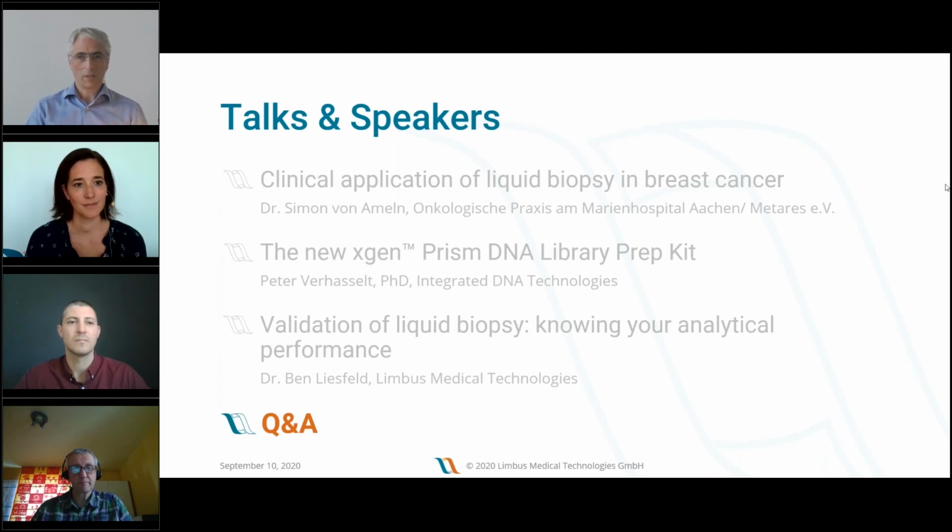A larger region of interest means that you need to invest more money into sequencing capacity to achieve the required depth of coverage. So putting a lot of thought into those calculations in the beginning really pays off in the end, because you're not wasting time and money designing too large a panel, and it really makes sense to focus on the regions of interest that are important.